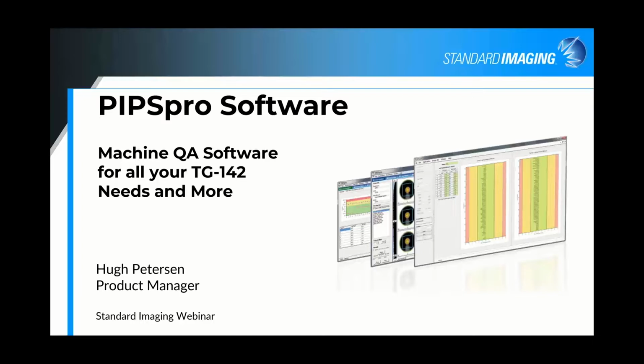I am the product manager for standard imaging for our PIPSpro software, our machine QA software that covers just about all your TG-142 machine QA needs and more. Today, I'm going to give you a somewhat brief overview. It won't be an in-depth view of the software at all. I invite you to feel free to get in touch with us to take a look at the software more in depth. I'd be happy to give you a deeper dive into the software. But today, it's just geared to be an overview of what we offer for the software.